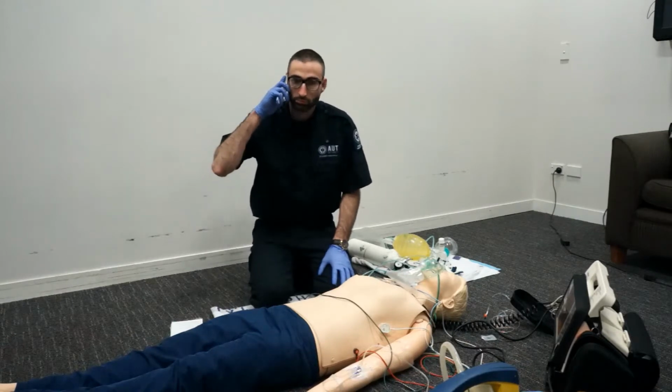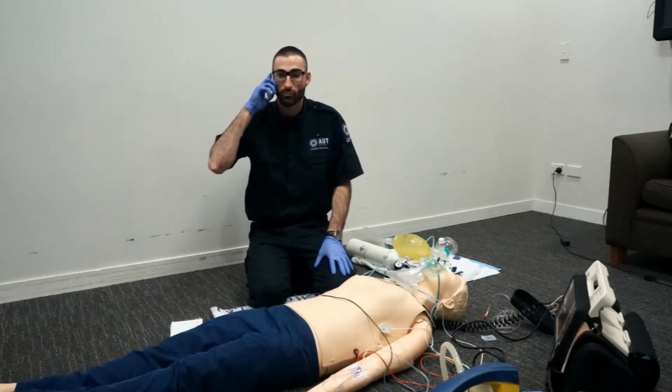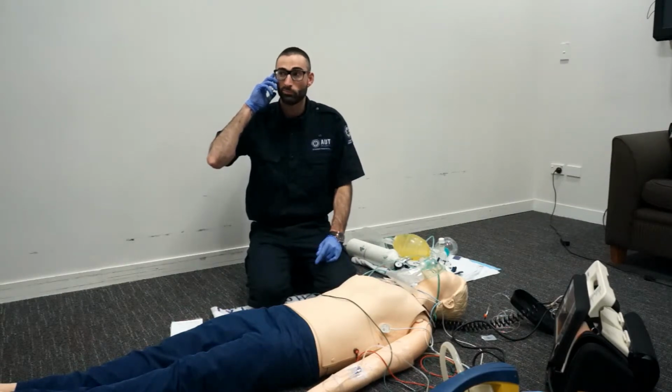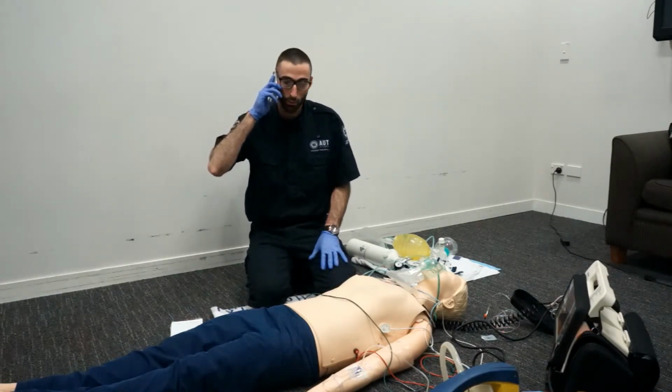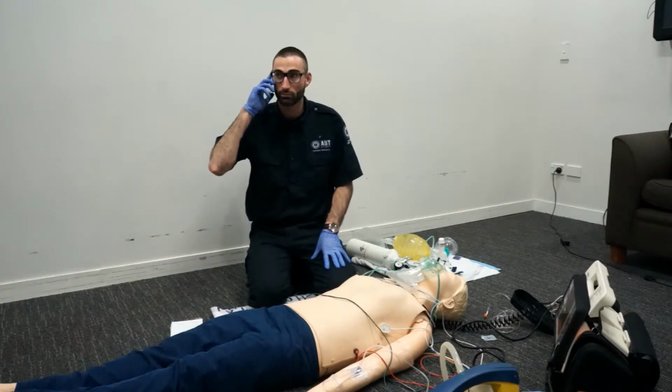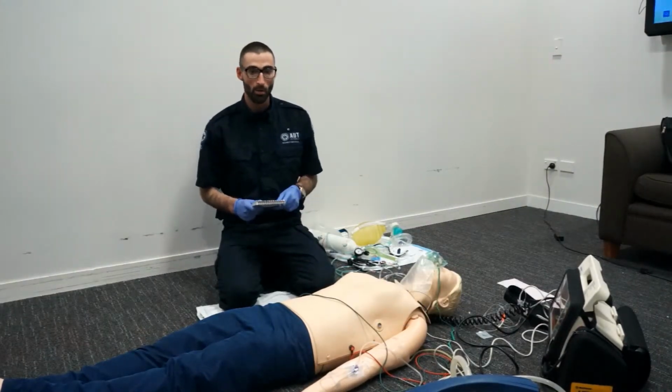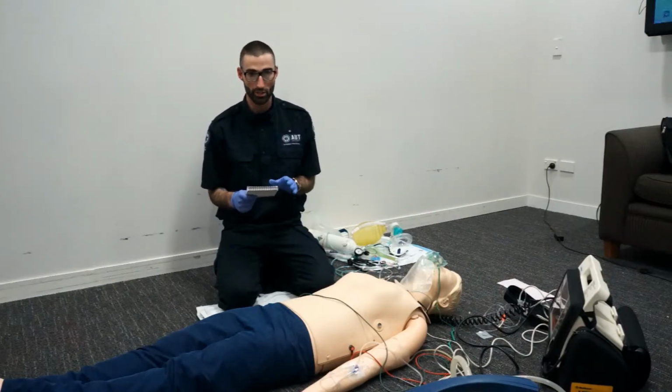AT1, Control. AT1, go ahead. We're requesting an R50 backup please for RSI. Copy, 10 minutes. Roger that, we'll go ahead and prepare the RSI. Thank you. Endorsed ICP backup en route. We can go ahead and check off the RSI preparation checklist.